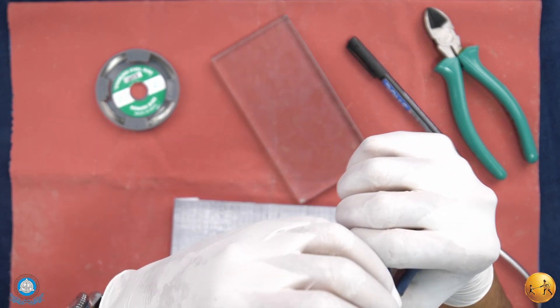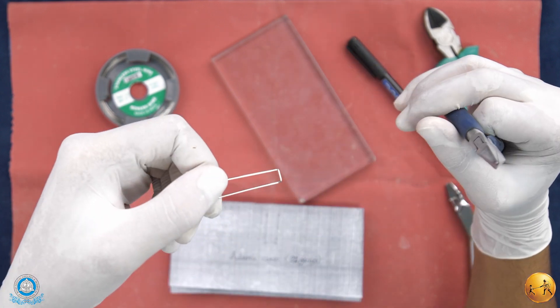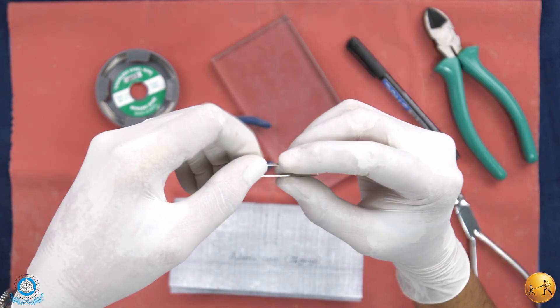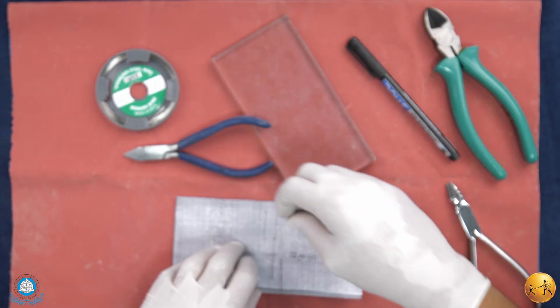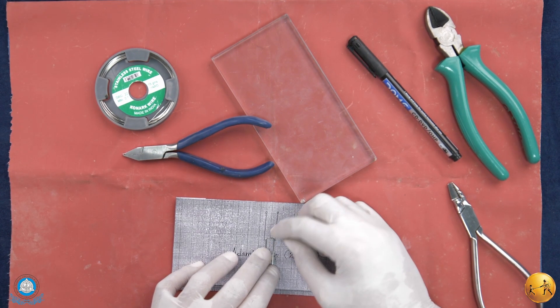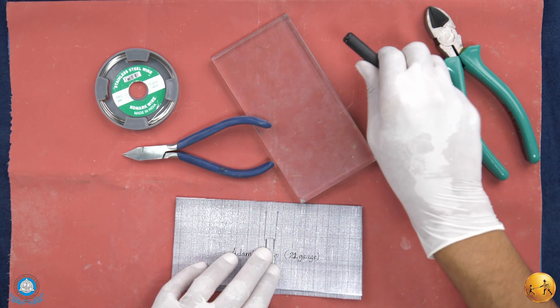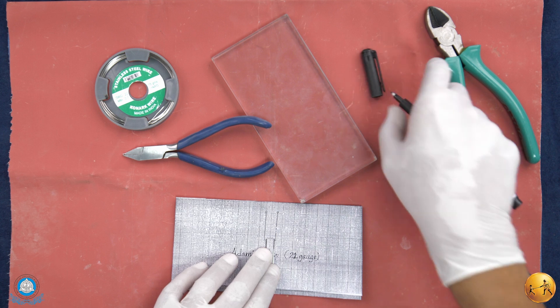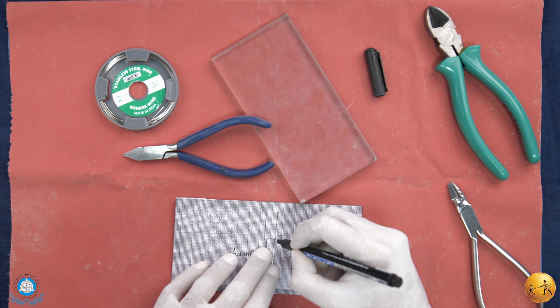This is the second bend that we have given. We have now given two 90-degree bends. We will keep our wire bending on the outline and then mark two more points to determine the length of the arrowheads.